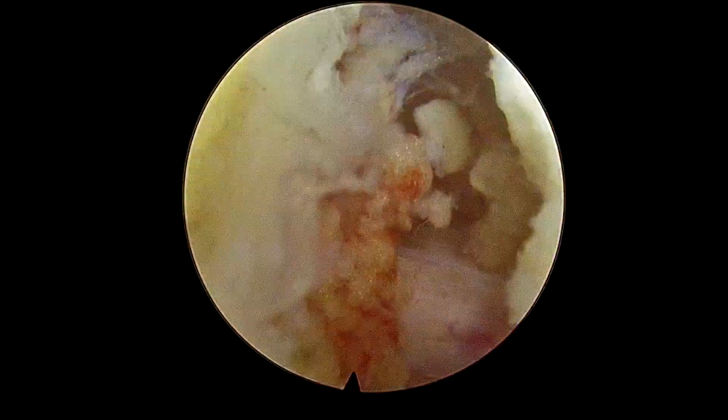So slowly the lateral border of the ligamentum flavum has become visible here. You can see.